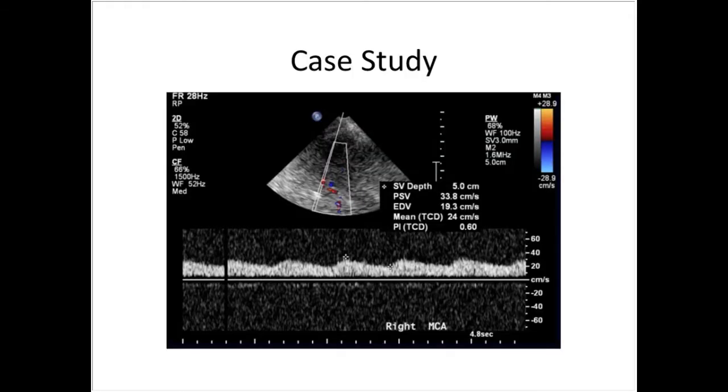So we did some transcranial imaging, and here you see the complex collaterals, but no MCA that we could find. And here's the slowing of the systolic upstroke. As everyone again knows, it's consistent with a proximal hemodynamic lesion.